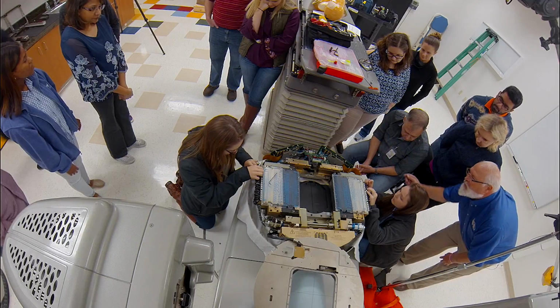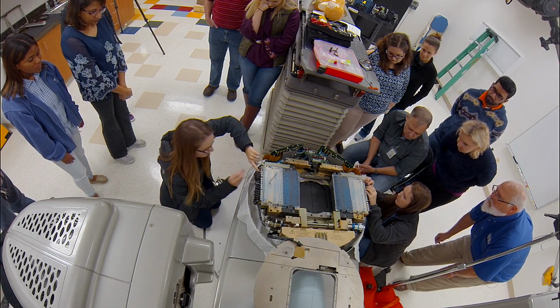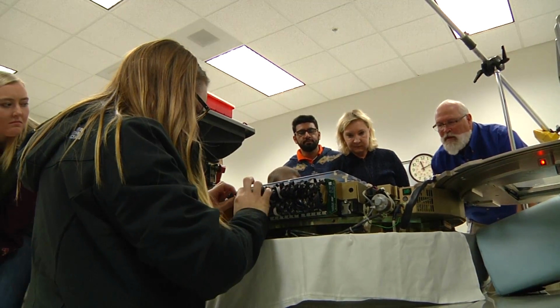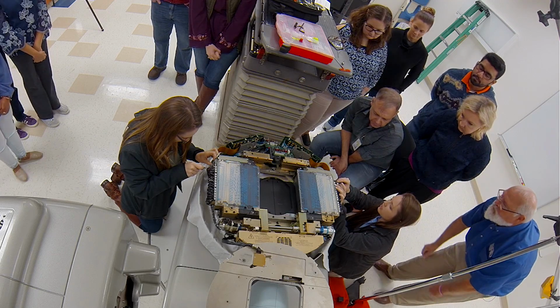So which one did you take off? That one, yeah? So if you push on them, do you feel the squishiness? Yeah. Okay. Do I undo this one? Yep, go ahead and take that off. Do I just pull on it? Just take it underneath, close to the connector, and you can just wiggle it side to side and it'll come right off. Gotcha.